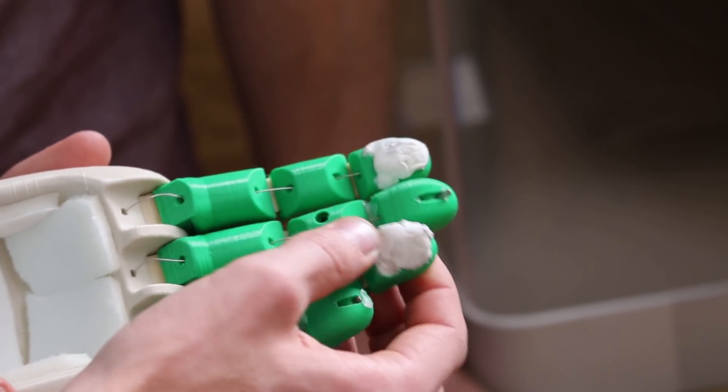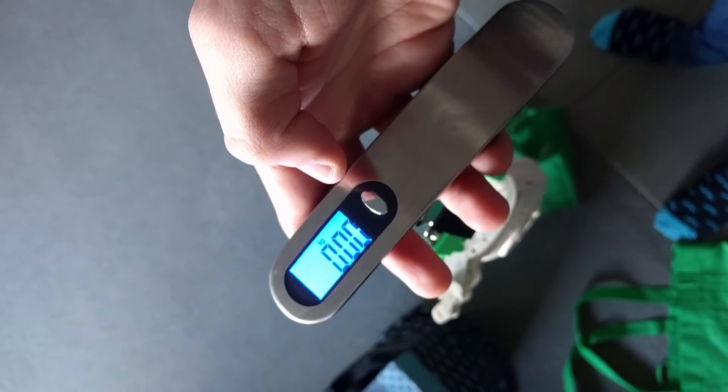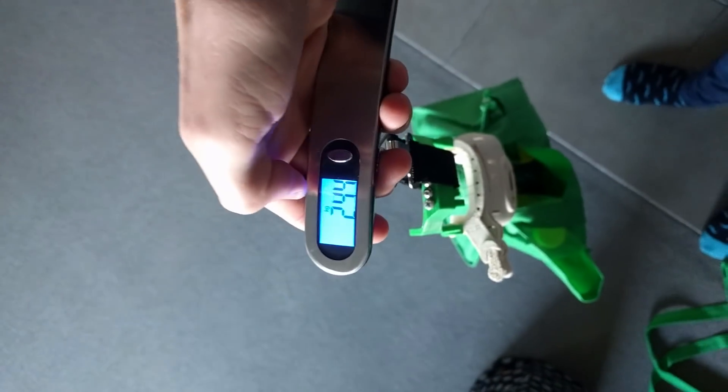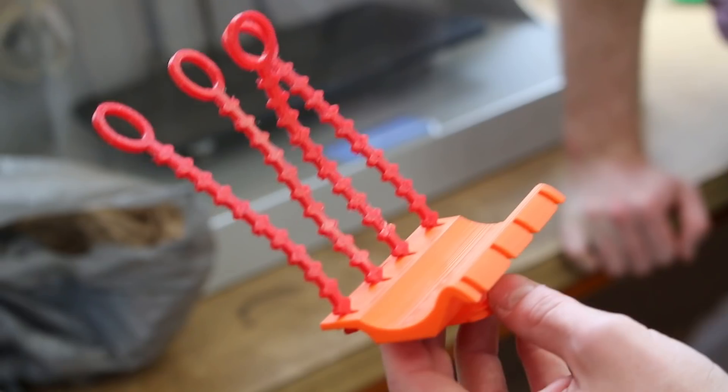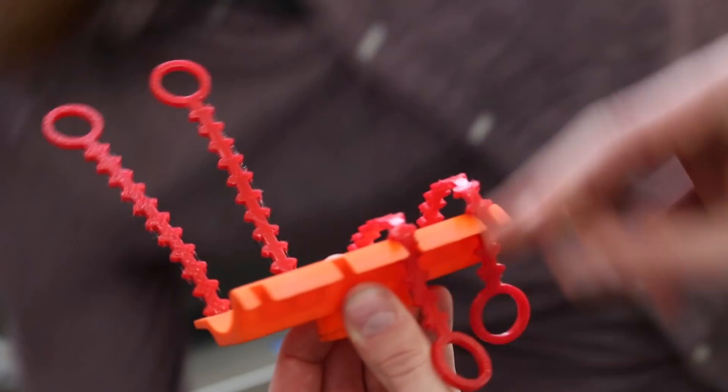We're pretty happy with our progress so far. We think that we've really hit some of the milestones that we wanted to achieve. We had three main design objectives which we wanted to complete: the locking of the hand grasping position, the addition of the tool holder, and also increasing the grip strength on the fingertips. We've made significant headway with all of those to a point where we're ready to start testing it on participants.